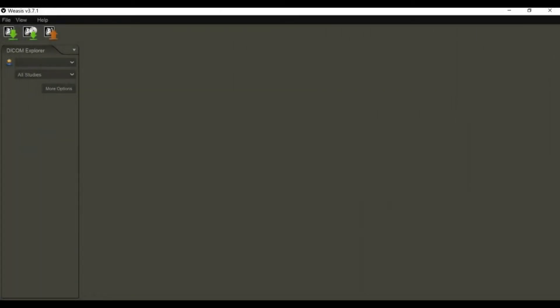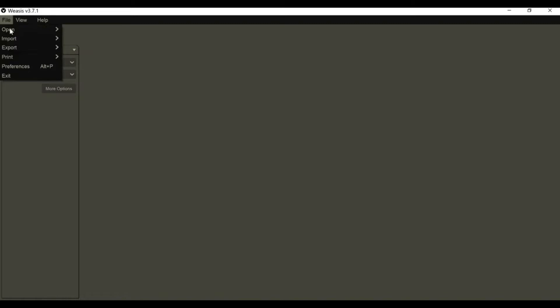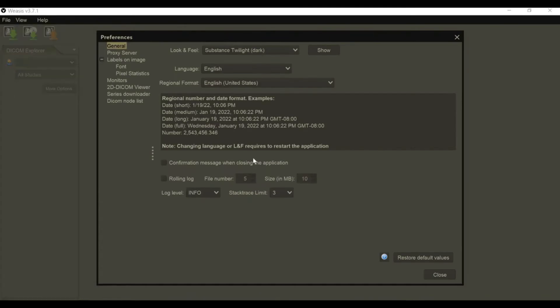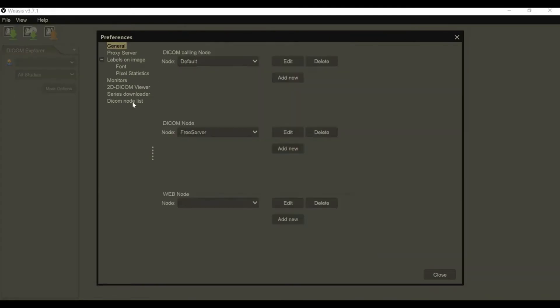This is how to configure Weezus, which is a DICOM viewer for PC. You're going to go to File, then Preferences, and then DICOM node list.